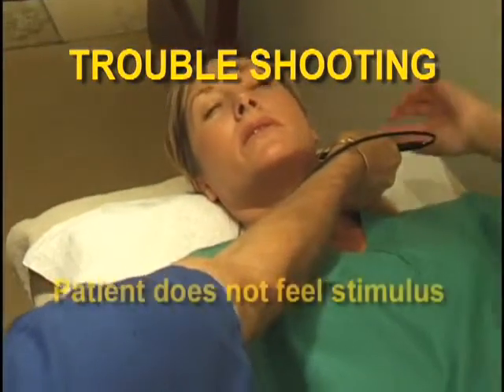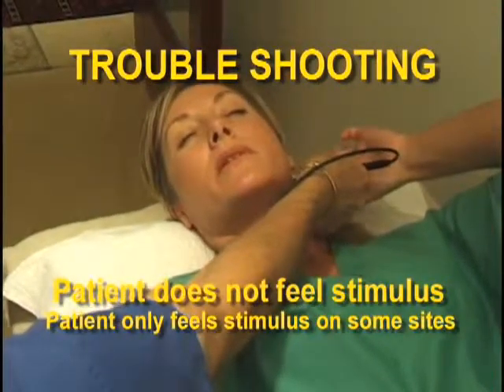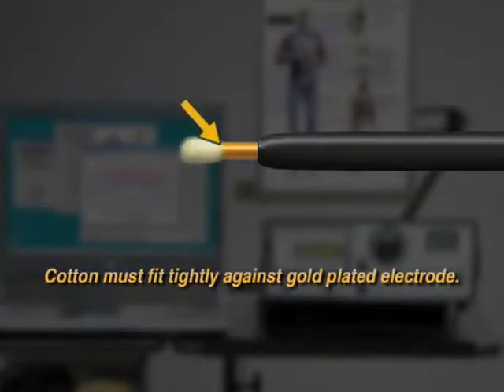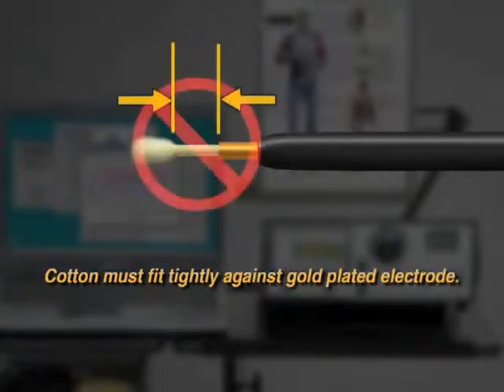If the patient says he doesn't feel the stimulus or only feels it at some sites and not others, you may have a technical problem which can be remedied with a few simple steps. Be sure that the shaft of the cotton swab is trimmed close enough to the end so that it fits deeply into the gold-plated barrel of the test electrode. The cotton should press tightly against the gold plating. Current will not flow if the back of the cotton tip is not in contact with the gold-plated barrel.